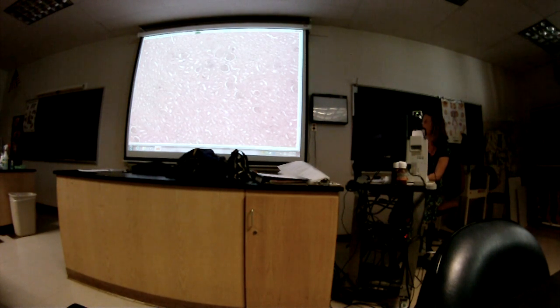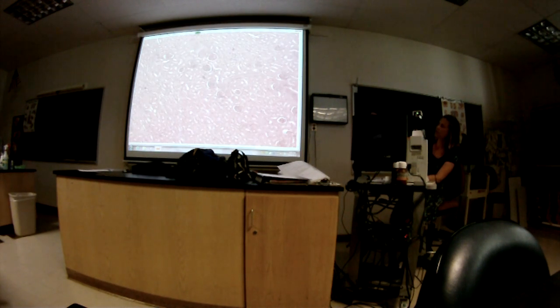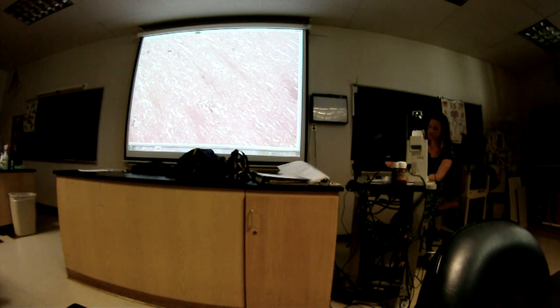Kidney. The kidney, yeah. Question 2, I zoomed in on one of these and I said it was 2 structures, composite structure, 2 together. What is that? Renal corpuscle. Yeah, that's the only answer for that. And then question 3, I moved this way and on in here and said, what is this general region of this organ called? The renal medulla. Renal medulla. And then we went question 4.